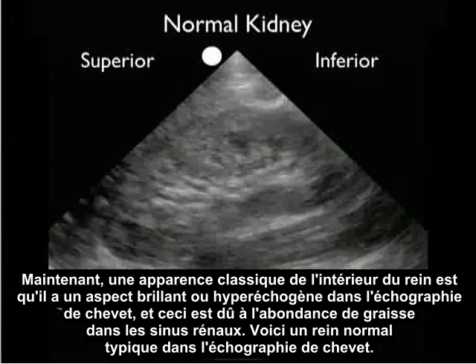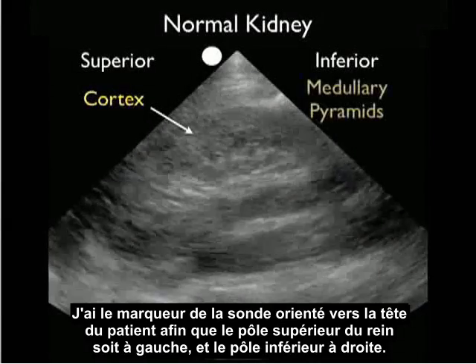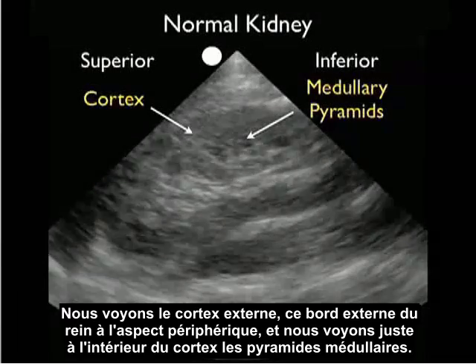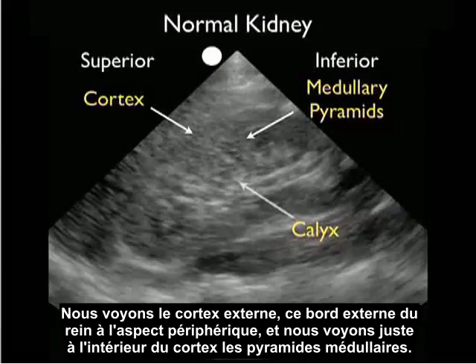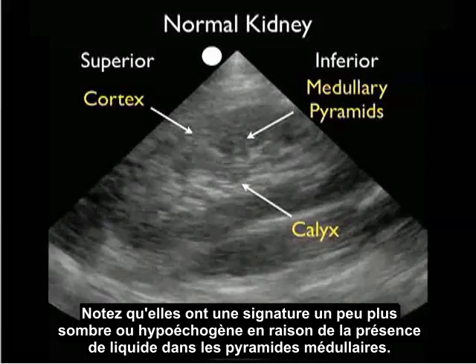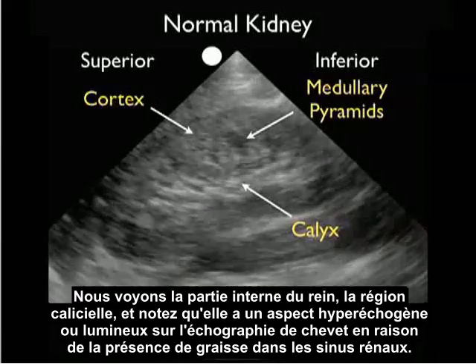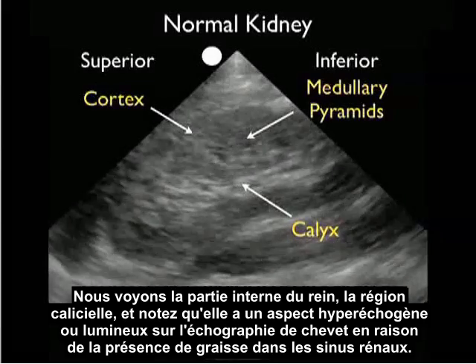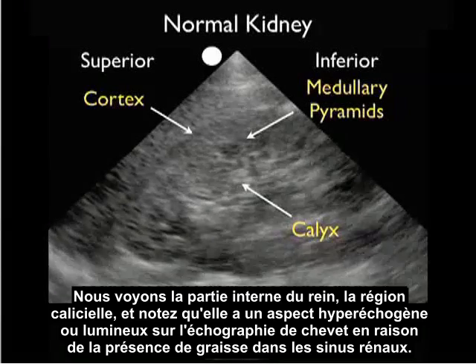Here's a typical normal kidney on bedside ultrasound. I have the probe marker oriented towards the patient's head, so the superior pole of the kidney is to the left, inferior to the right. We see the outer cortex, that outer rim of the kidney, to the peripheral aspect, and just interior to the cortex, the medullary pyramids. Notice that they have a little bit of a darker or hypoechoic signature, due to the presence of fluid within the medullary pyramids. We see the inner part of the kidney, the calyceal region, and notice that it has a hyperechoic or bright appearance on bedside sonography, due to fat within the renal sinuses.